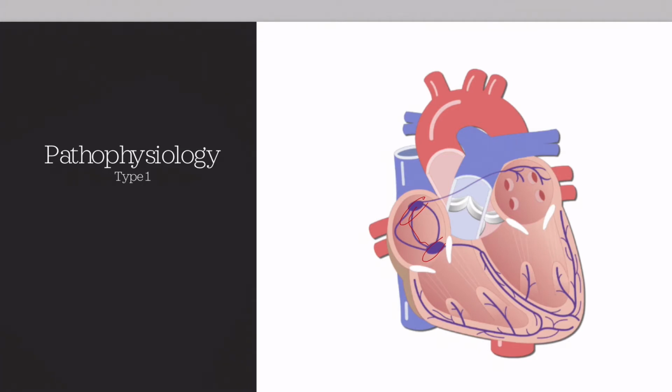So important causes of this include drugs, increased vagal tone, inferior MI, or trauma. Generally, we're going to have some amount of fibrosis, which is causing our signal to slow down. So these are broken up into types based on their severity. Our first one here is type 1.